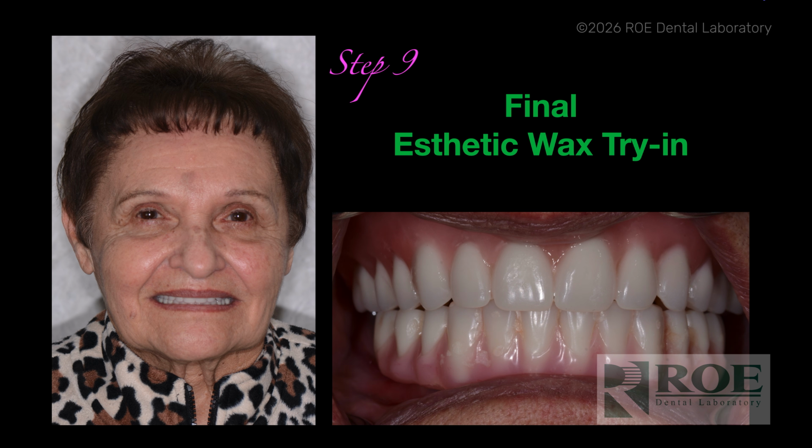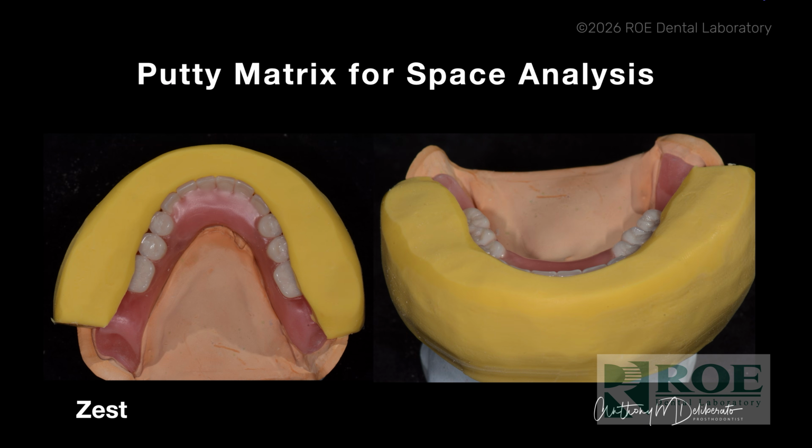We check our bite, we're dead on. The patient's happy with the aesthetics. I was kind of of the feeling she could show a little more tooth. So before we process this, we were going to make some adjustments to give her just a little better show, a little better aesthetics. Now here's that example of how I like to evaluate my restorative space before processing anything.